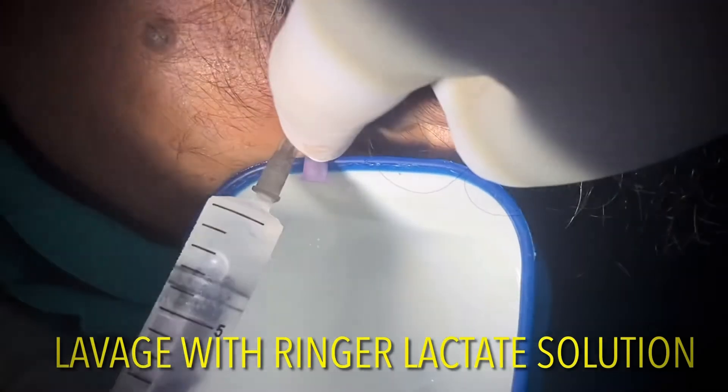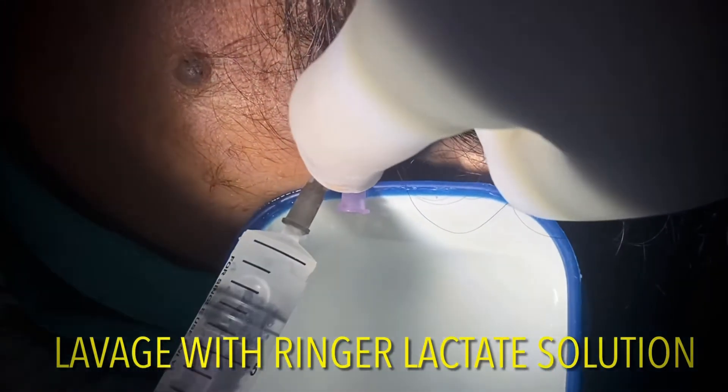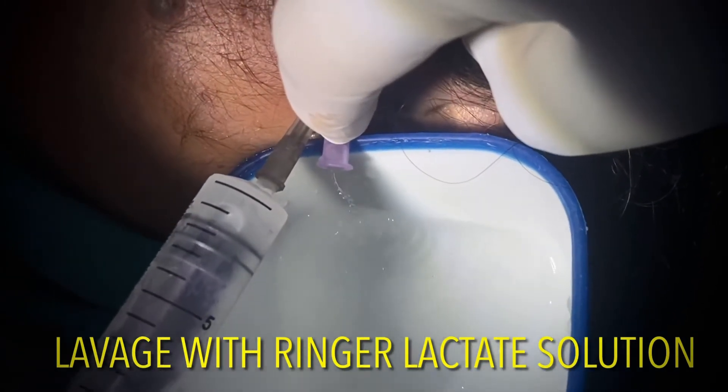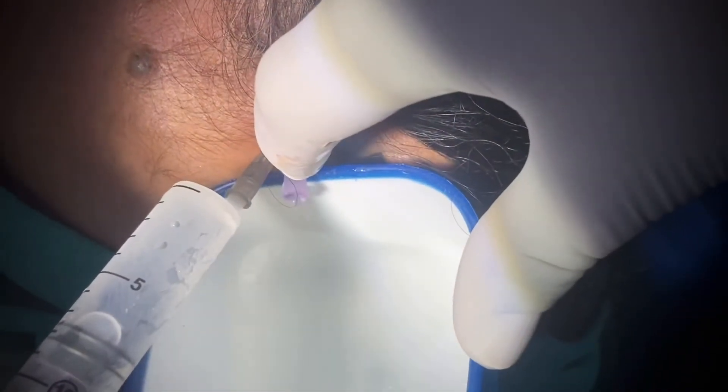After this procedure the patient may feel smoothening of joint movements, as by the help of hydraulic pressure there is a clearing of any fibrous adhesions that are present in the joint.